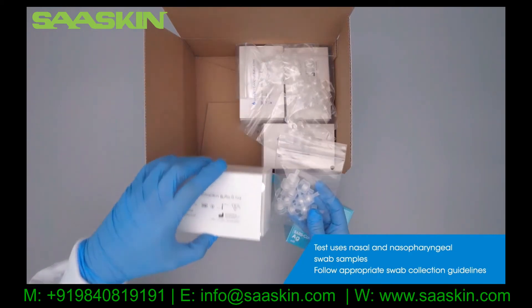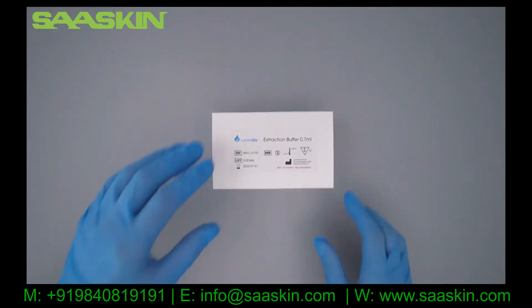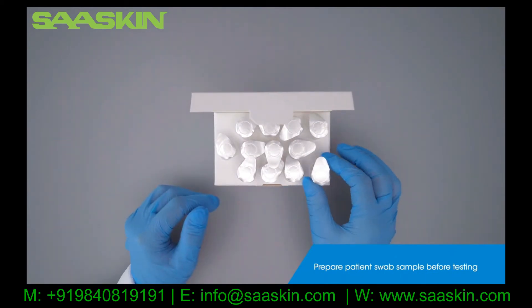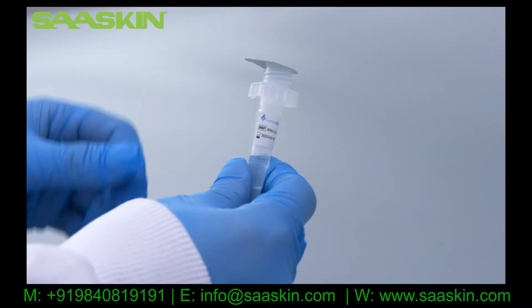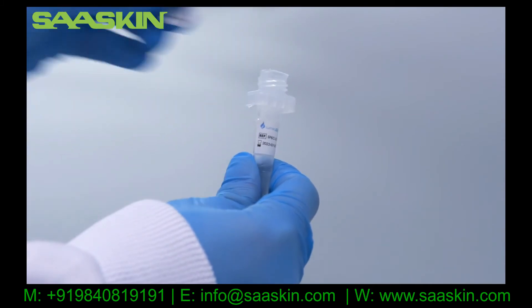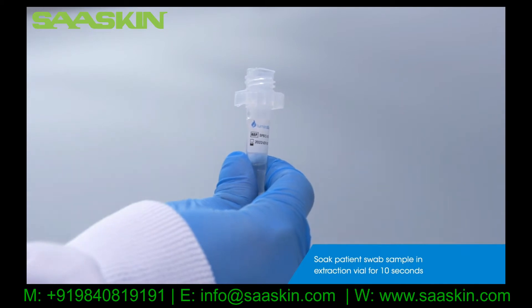Follow the appropriate swab collection guidelines and swab manufacturer's recommendations. Prepare your patient's swab sample using the extraction buffer. Remove the seal from the top of the extraction vial, then place and soak the patient swab in the extraction buffer for 10 seconds.